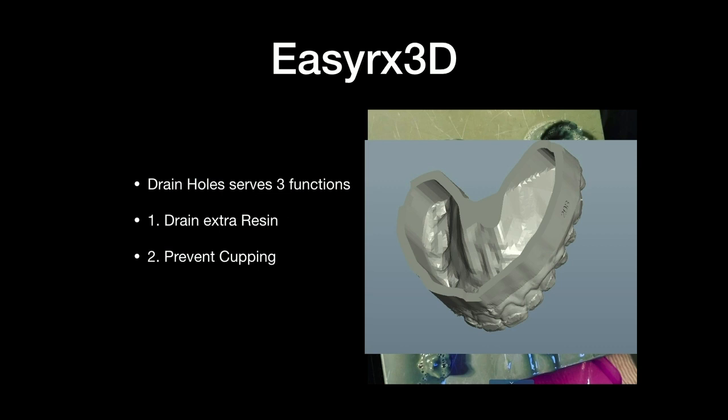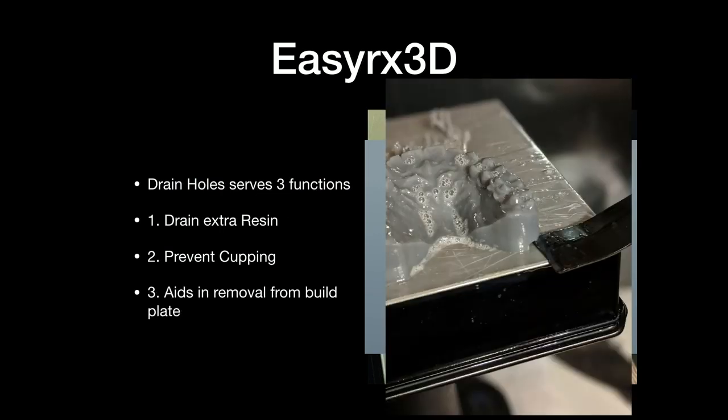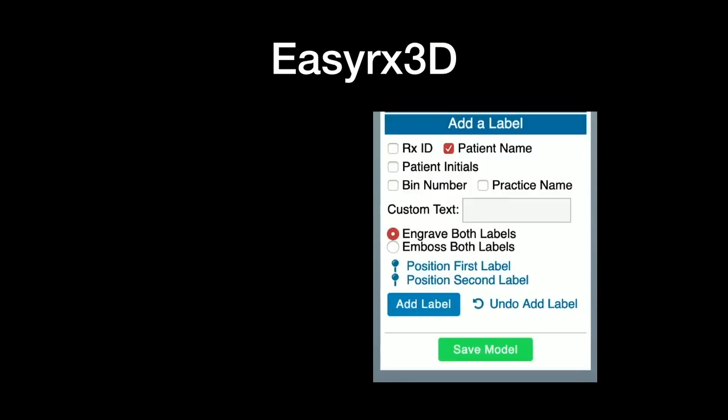So it prevents that, and then it aids in the removal from the build plate. If y'all mess with them, sometimes you really got to scrape hard. So I got my little tool, and there's a little piece of the drain hole. I just kind of put my tool in there and twist a little bit, and it pops off.